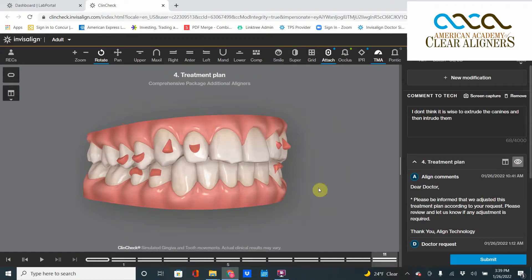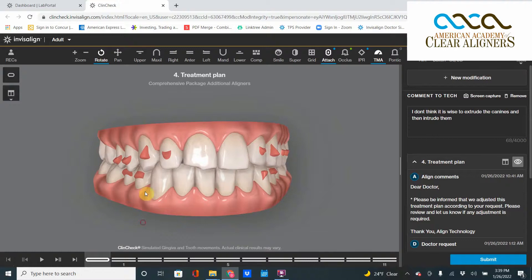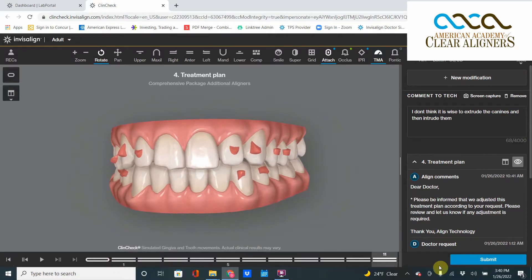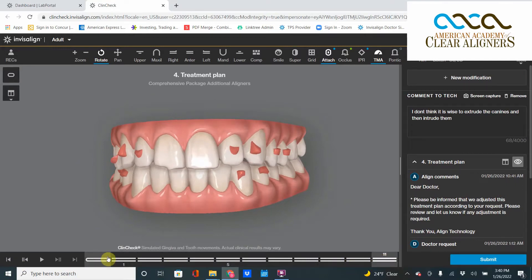So I write back: remove extrusion of number six and number eleven. They send me back a new ClinCheck — but watch what they send me. All I want is for those canines to stay where they are. I don't want those canines going down at all; there's no reason for that. But if I wasn't paying close attention, I'd say, 'Oh very good, the canines didn't extrude — exactly what I wanted.'